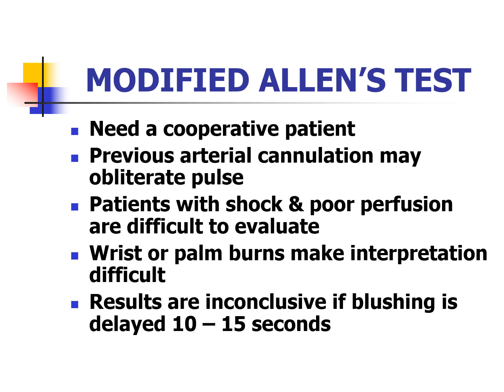Results are inconclusive if blushing is delayed 10 to 15 seconds. In other words, their collateral perfusion is still there, it's just delayed. So that means it's inconclusive. In this case, it would behoove you to move to the other wrist and check the other site.